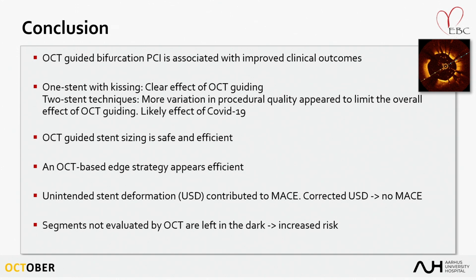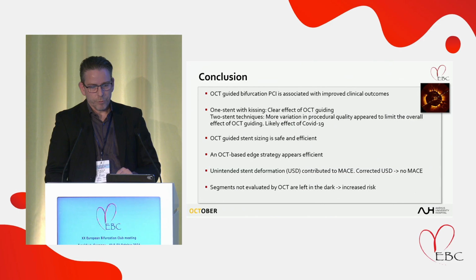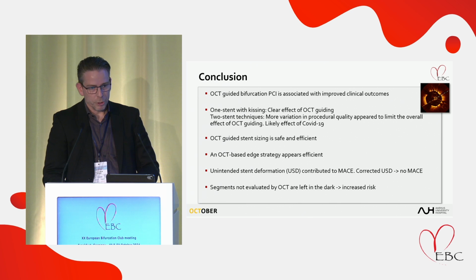OCT-guided stent sizing is safe and efficient. An OCT-based edge strategy appears efficient. Unintended stent deformation contributed to MACE. If you correct unintended stent deformation, you will have no additional risk. Segments not evaluated by OCT are left in the dark and associated with increased risk. Thank you very much.